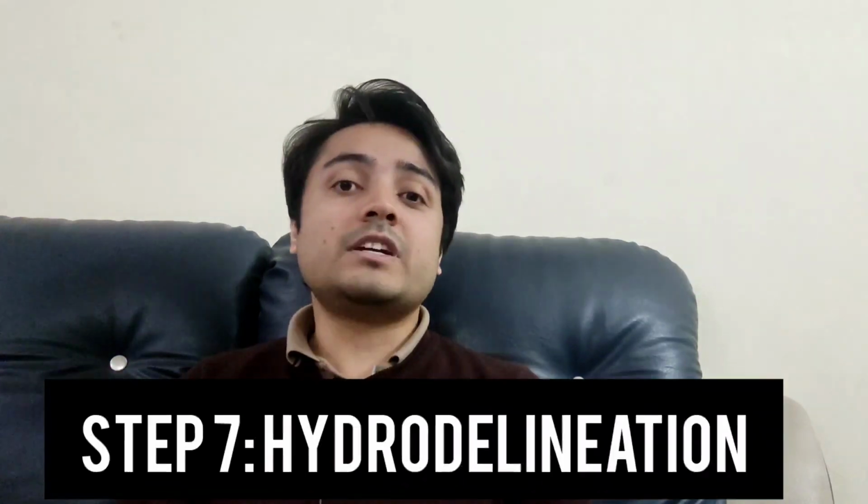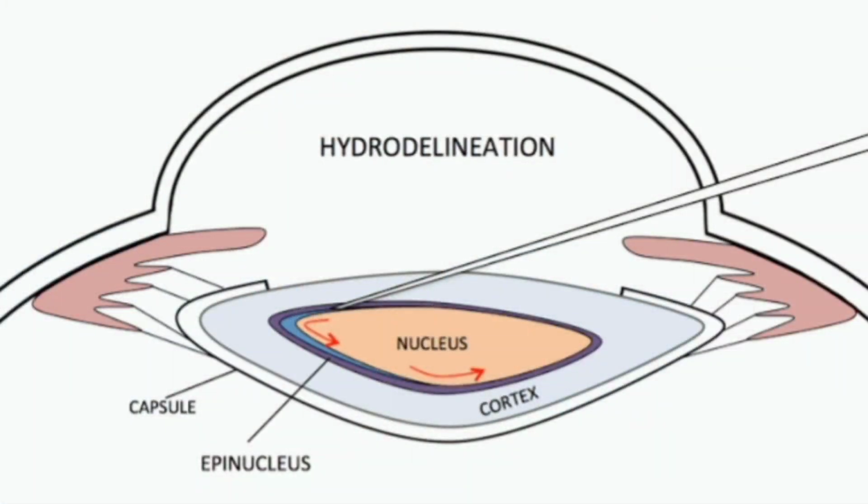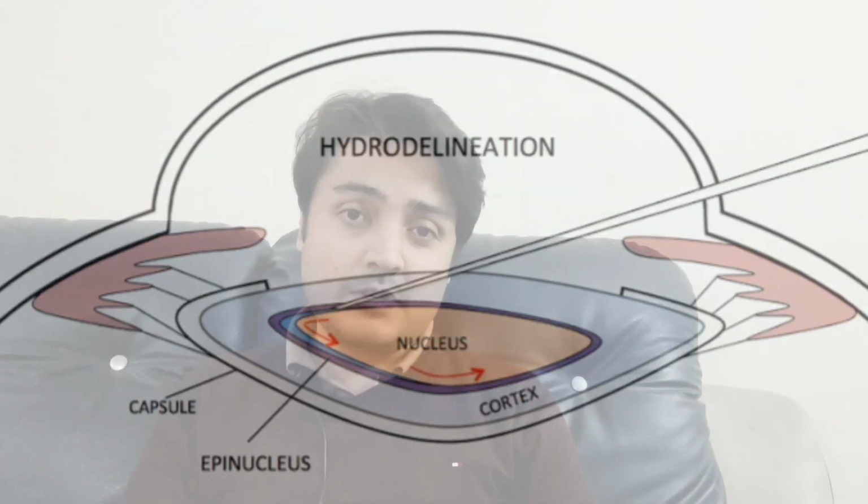After this, hydrodelineation is done, which means hydro, again water, is being introduced, but at this time it is being introduced into the nucleus to separate the nucleus from the epinucleus, or in other words to loosen it up so it can be extracted easily.